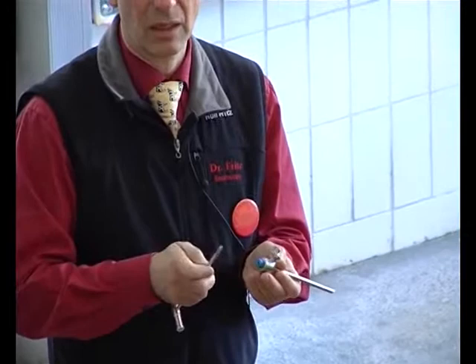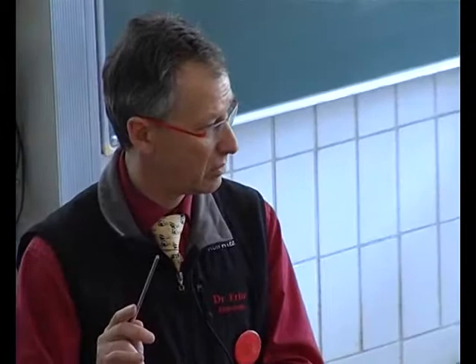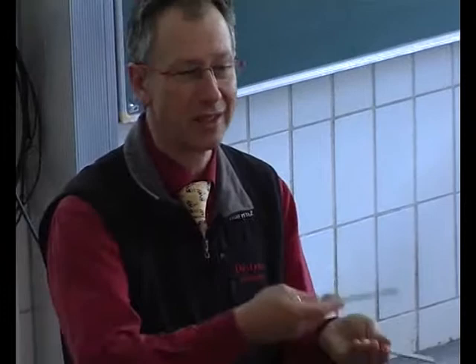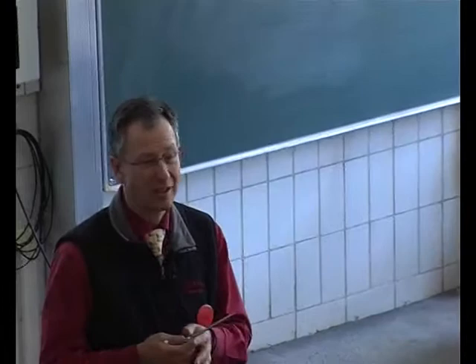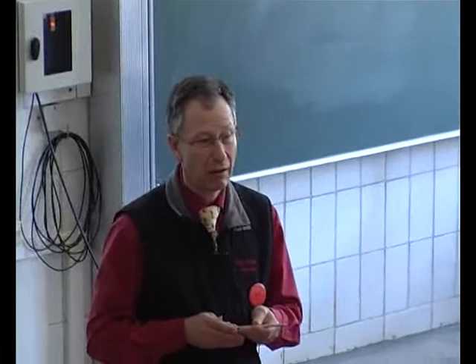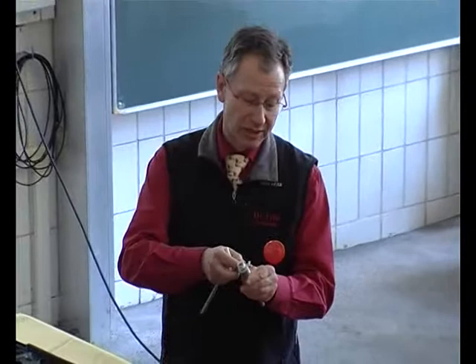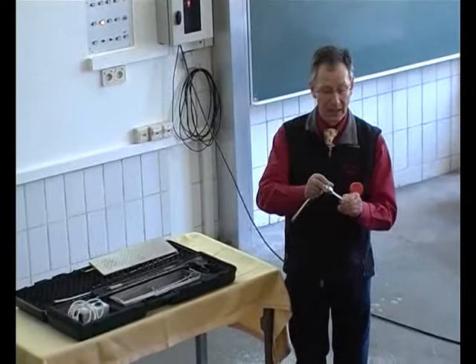So that's all. Please note also that the tip of this trocar has a special sharpness. You don't realize this when you use it because it's nice and smooth to use, but when it's getting blunt, then you will feel it, that it's really tough to push through the trocar through the cattle tissue. So please have a close look at it as well. And from this side, the 8 mm trocar, which is fitting closely to the scope. Please make sure that you sometimes oil with silicone oil or silicone grease this stopcock for insufflation.